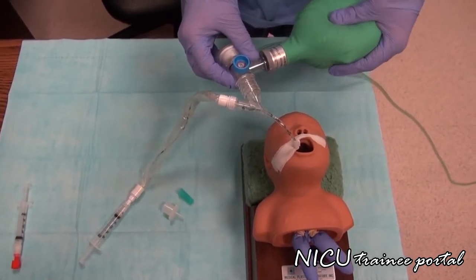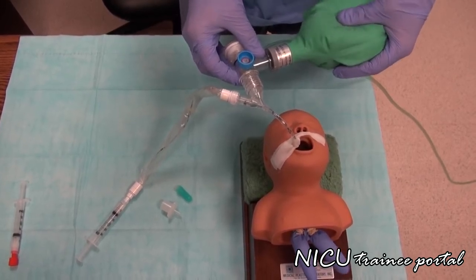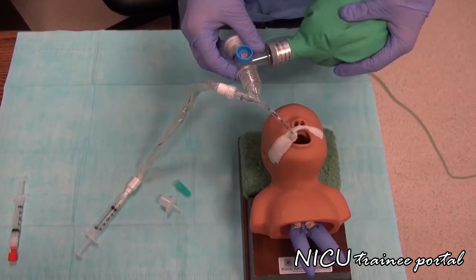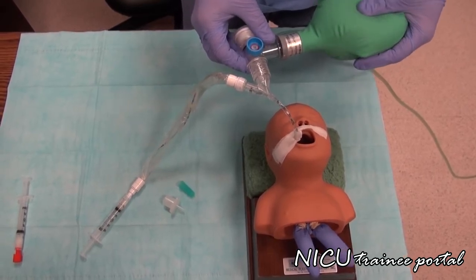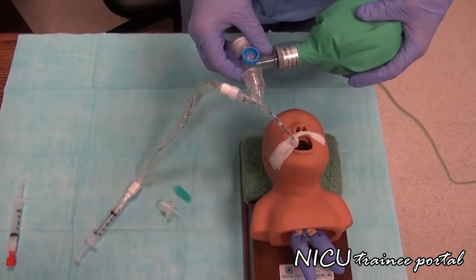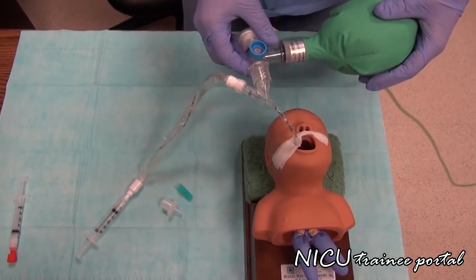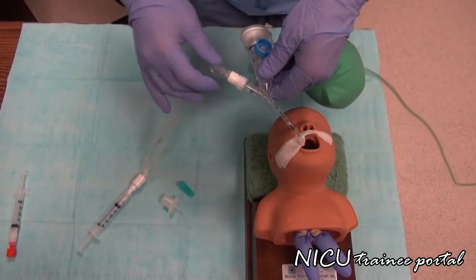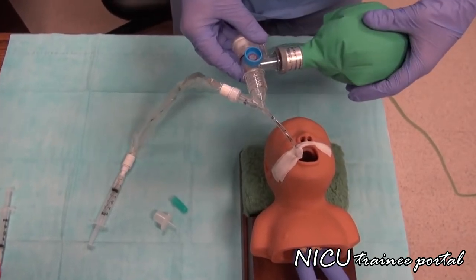So the next step is inserting the catheter to proper placement, administering the surfactant and removing the catheter, making sure our patient is stable through the process. So here we have to properly measure the correct depth of the catheter in the ET tube and then administer the surfactant. So here, for the purpose of the video, I will focus on inserting the catheter. You can pretend we are still manually ventilating the baby through the whole procedure.